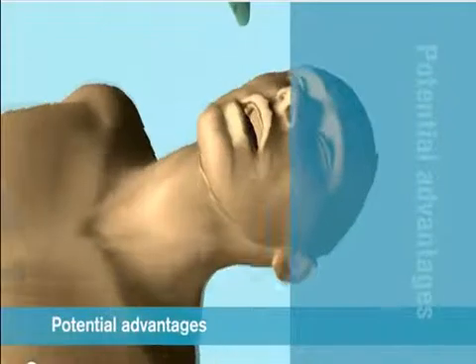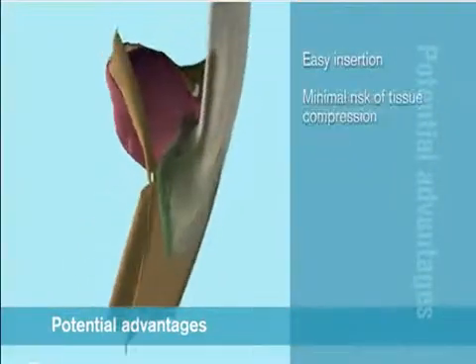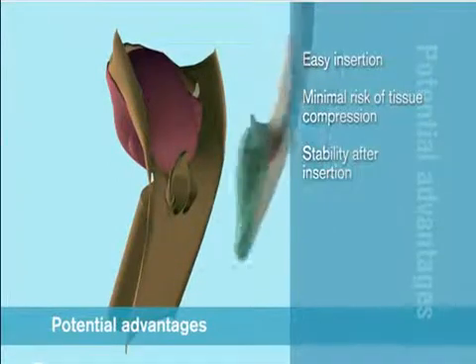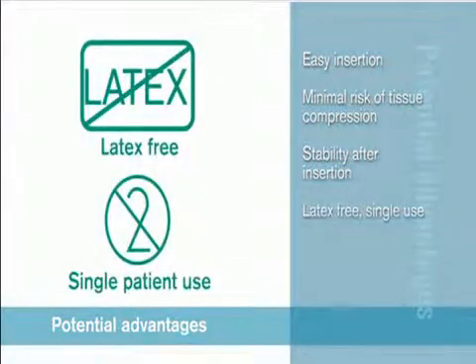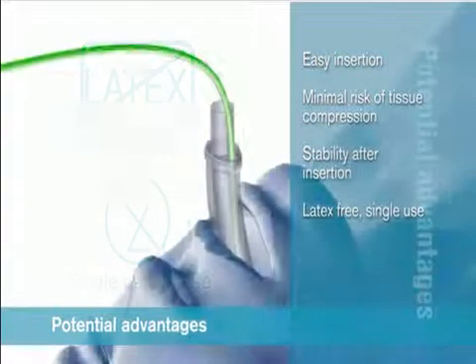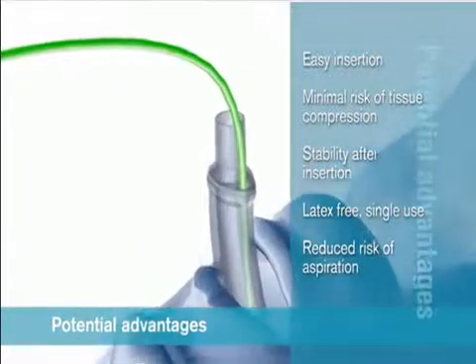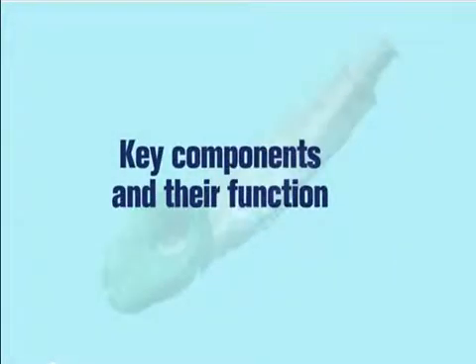A supraglottic airway without an inflatable cuff has several potential advantages, including easier insertion, minimal risk of tissue compression, and stability after insertion. iGel is a latex-free single patient use device that has a gastric channel to reduce the risk of aspiration. Key components and their function.